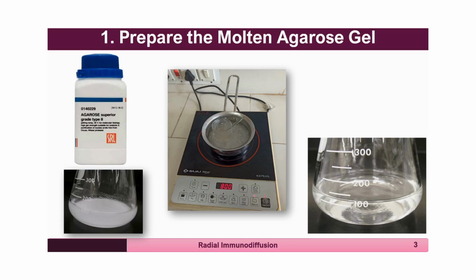As the water starts boiling, the agarose will start melting. And once it melts completely, there will be no particles in the buffer and it will be a transparent solution. The 2% agarose solution prepared in this manner is now ready to be used for the preparation of slides. See that there are no particles in the agarose that is dissolved in the buffer.